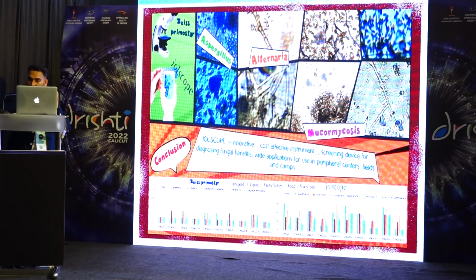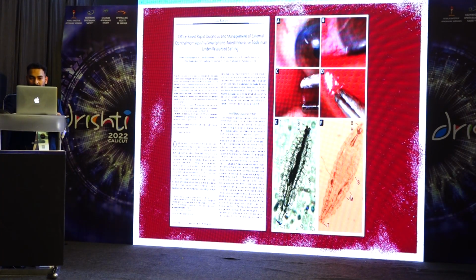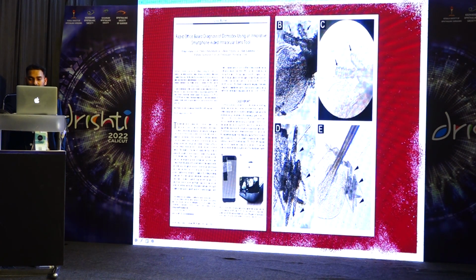So we can detect fungus, but not every time can we actually identify the species of the fungus. We also used it to diagnose parasites like Oestrus ovis larvae and also Demodex. With this, I would like to say that with an IOL, implanting it in cataract surgery, and using it in extraocular ways, we can use it for imaging, like in anterior segment imaging and for microscopy.